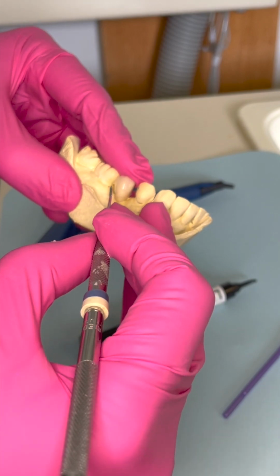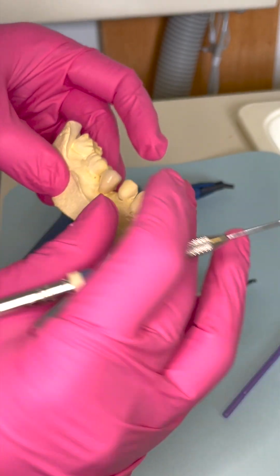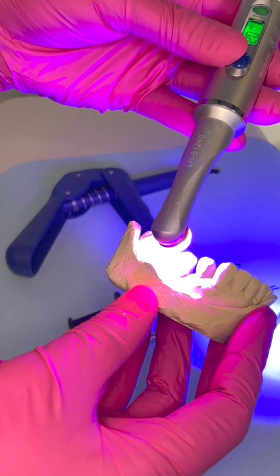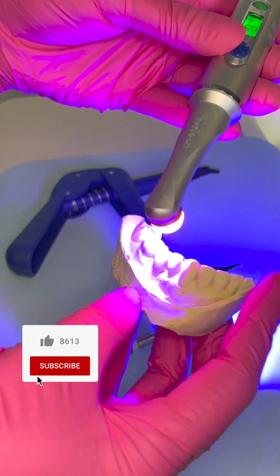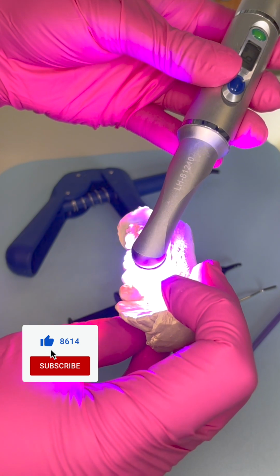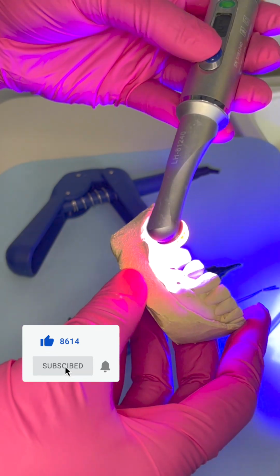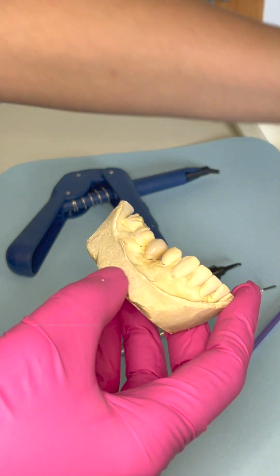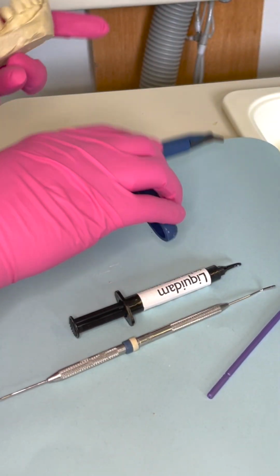And as you can see, it's very narrow compared to the space. So using something like that expired composite helps me fill in that space, and you'll see how I'll start making it like a wider tooth that I need it to be.